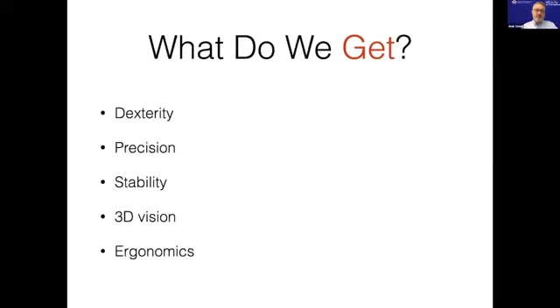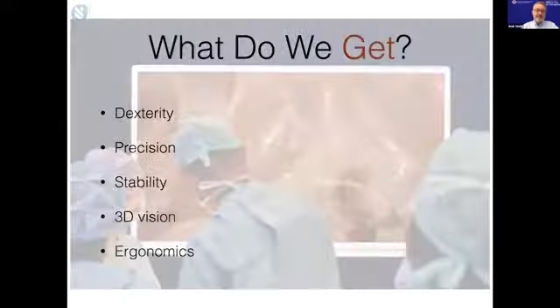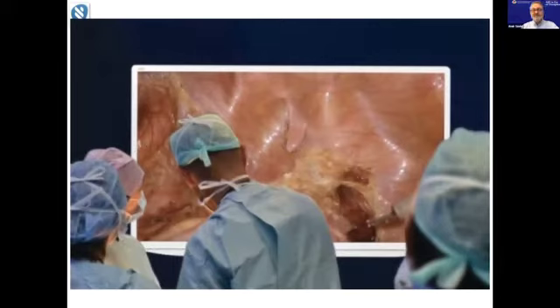We all know that in abdominal surgery, we can err by millimeters or even centimeters sometimes, and nothing bad will happen. It would make much more sense to use very precise robotic systems for microsurgery, for brain surgery, but not for abdominal surgery. And 3D vision, you can buy today off the shelf fantastic systems, 4K or 3D, that show you amazing images. You don't need a robotic system to see in 3D or in 4K.